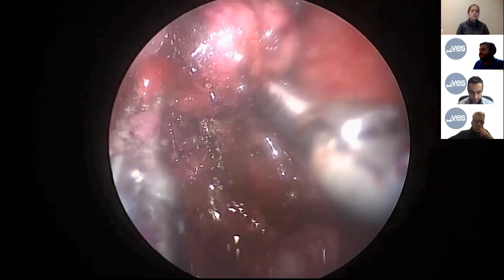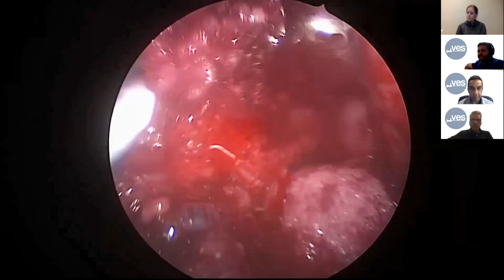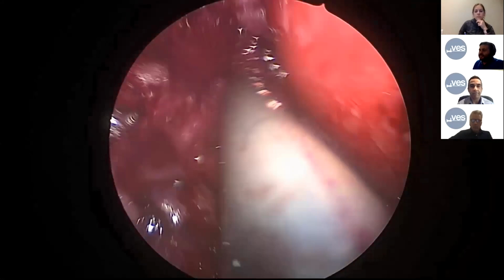We are taking out this little tumor. We always check for bleeding with 3 or less millimeters of mercury and aspirate all residual gas before closing. That is very important because residual gas in the retroperitoneal space could be the source of pain or discomfort for the patient.